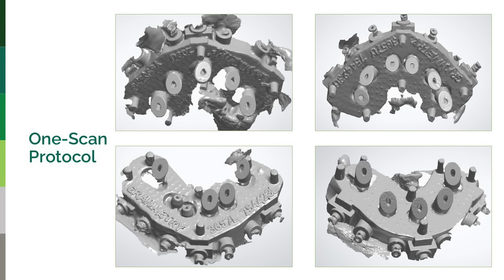You don't have to change the item that you're putting on the multi-unit abutment. You IOS it, and then you Micron Mapper it, and then you upload it. And that is the only scan. Of course, these are 4 different cases, but these are one scan each, right? So this would be just one scan with an IOS, a Micron Mapper, and upload. And that comes to Rowe, and then we introduce it back into the stack that we designed it.